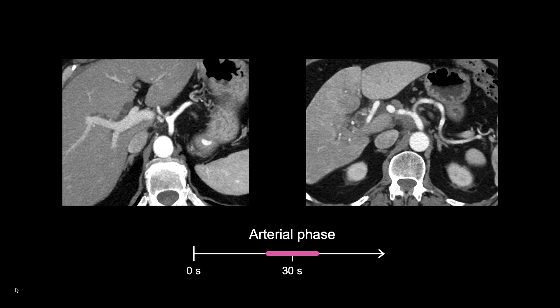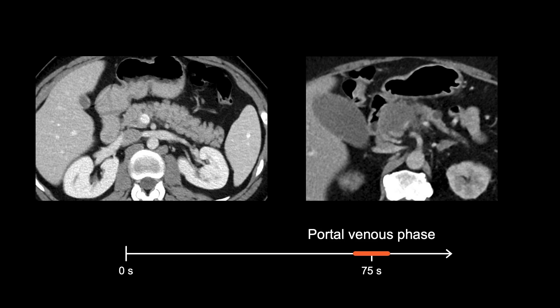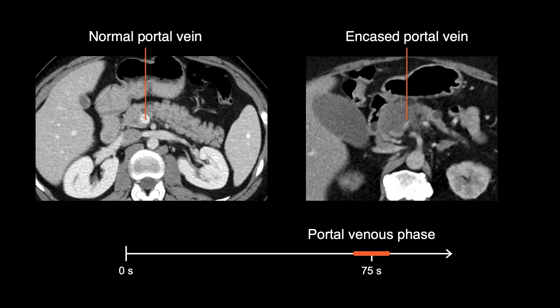In the example on the right, we can see soft tissue encasing the celiac artery, when compared to the normal celiac artery on the left. Similarly, here we can compare a normal rounded portal vein near the pancreas head to the narrowed, slit-like portal vein seen in this image on the right. This appearance indicates venous encasement by the pancreas head mass.